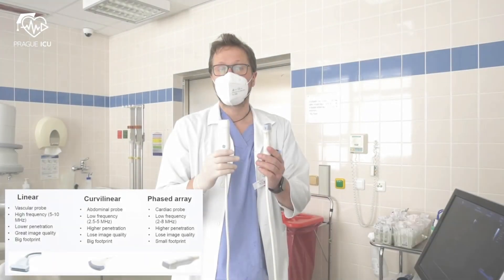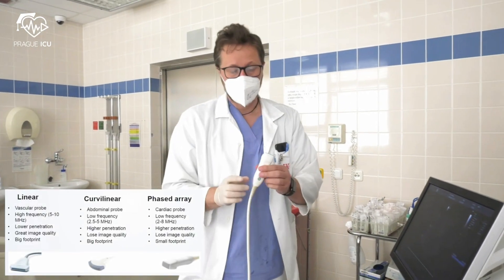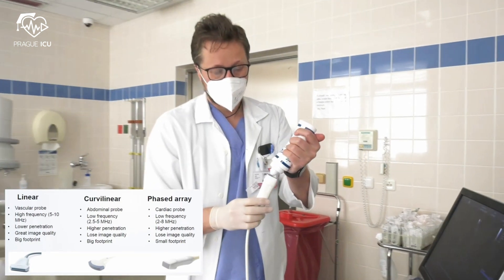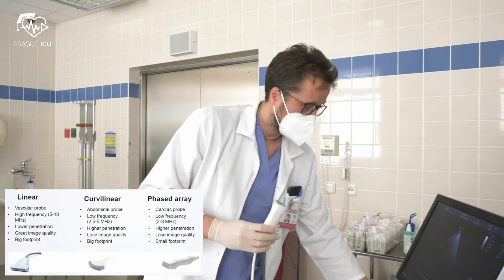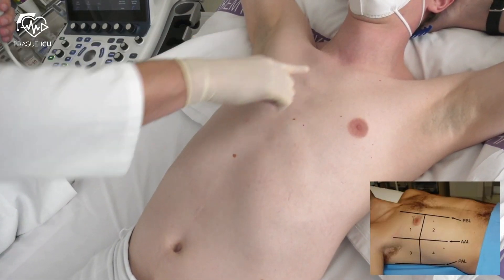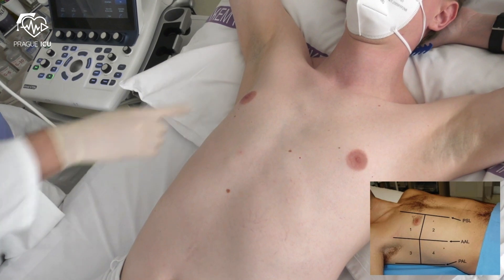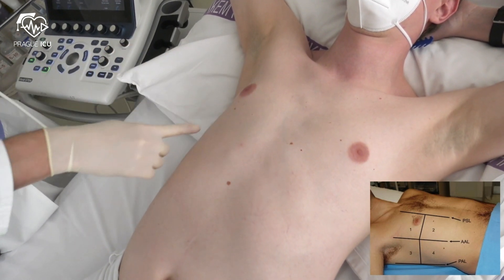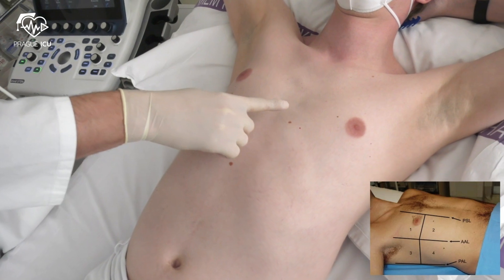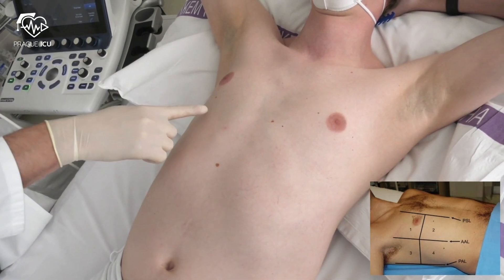We will start the examination with an echo or abdominal probe, which are suitable for evaluating the alveolar interstitial syndrome. Our scanning protocol comprises 12 zones, 6 regions in each hemithorax. These zones are demarcated by the parasternal line, anterior and posterior axillary lines. Upper and lower zones are roughly separated by a horizontal line passing through the nipple.